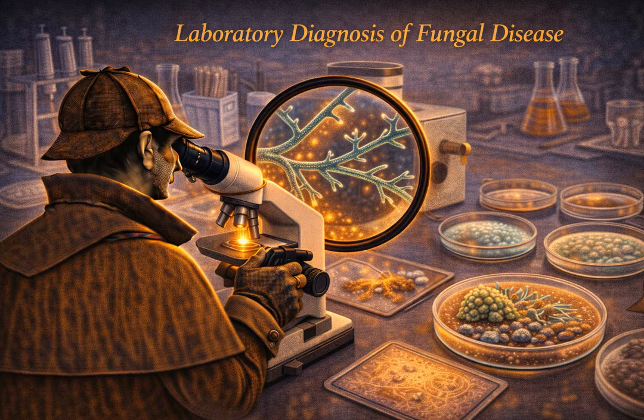Lasers. You take a tiny smear of the colony from the plate, put it on a specialized metal target plate, add a chemical matrix, and put it into the machine. A laser blasts the sample. This vaporizes the proteins inside the fungus and simultaneously gives them an electrical charge. That's the ionization part. So now you have a floating cloud of charged fungal proteins.